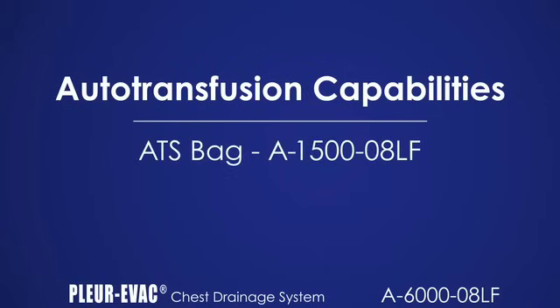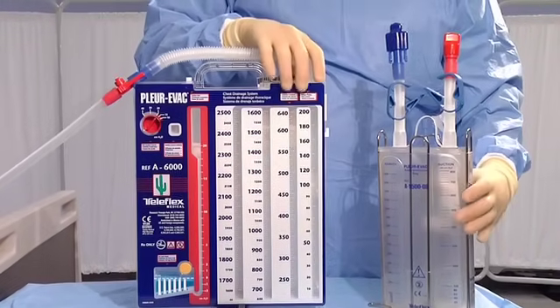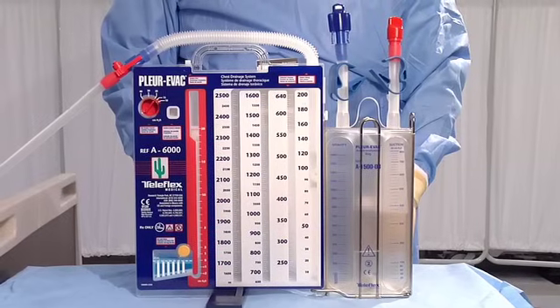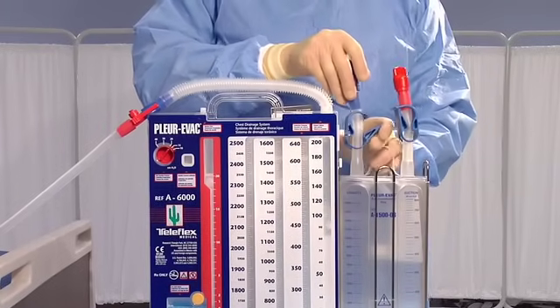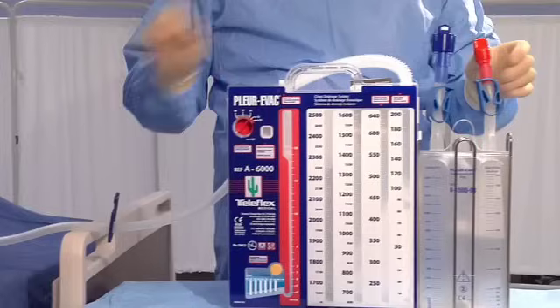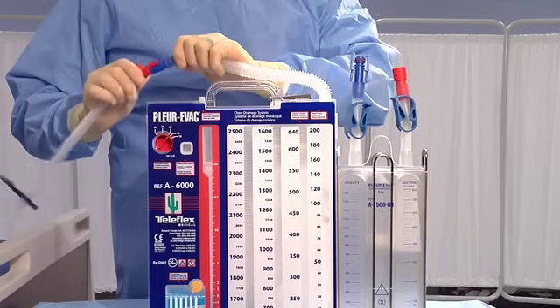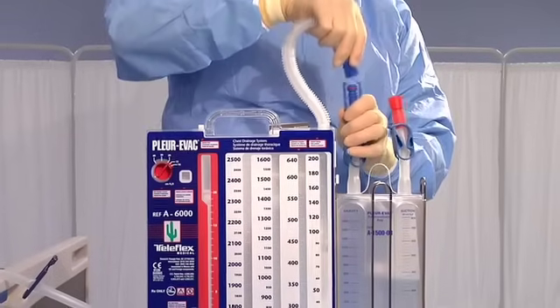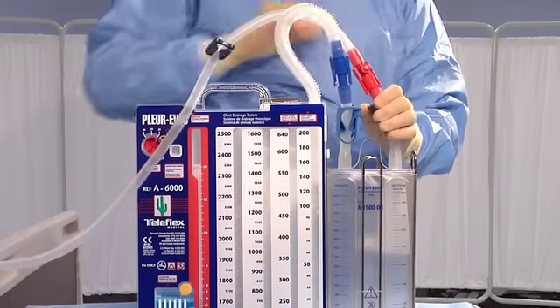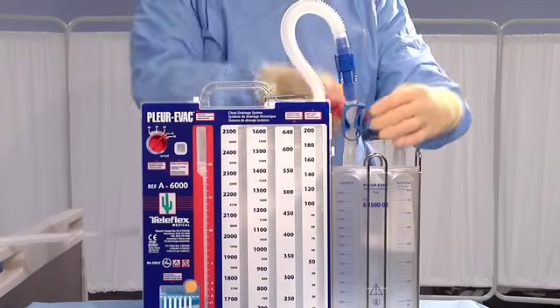The auto-transfusion bag, A1500-08LF, can be utilized to perform re-infusion when required. Obtain and unwrap the ATS bag. Attach the Plurivac bag to the side of the Plurivac unit using the foot hook at the bottom and the hanger on the side of the unit. Close the two clamps on the top of the bag. Close the clamp on the patient tubing and drain blood from the tubing back into the Plurivac unit. Disconnect the red and blue connectors in the patient tube. Remove the blue protective cap from the bag tubing and insert the bag connector into the blue connector on the Plurivac tubing. Remove the red protective cover from the collection tube on the bag and connect it to the red connector on the patient chest drainage tubing. Open all clamps and secure all connections. The auto-transfusion system is now operational.